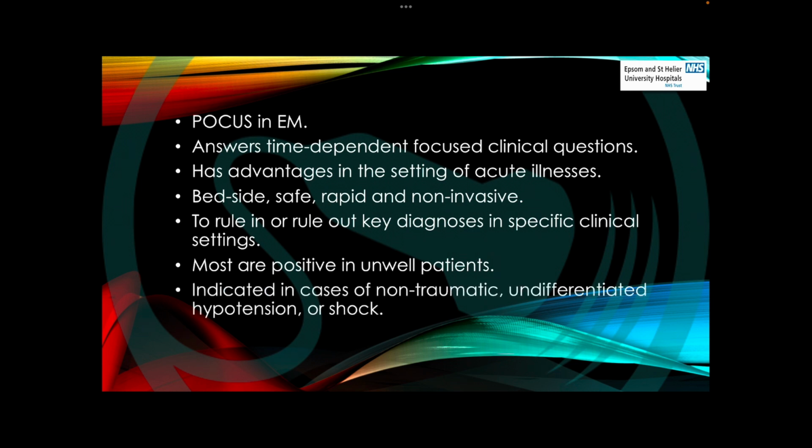These are indicated in cases of non-traumatic and undifferentiated hypotension or shock. Both protocols we are going to talk about examine the chest or abdominal cavities by ultrasound in order to rapidly evaluate for the reversible causes of shock and improve diagnostic accuracy. Each of these protocols combines many of the same core ultrasound elements, differing mainly in the exam sequence. So they are the same, but they are different in the sequences.